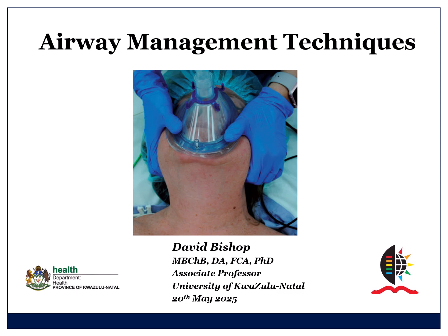Today I'm going to be covering airway management techniques, and that starts with an assessment, appropriate preparation, and then we're going to be looking specifically at the techniques of bag mask ventilation, intubation, the use of a bougie, and the use of a supraglottic airway device.